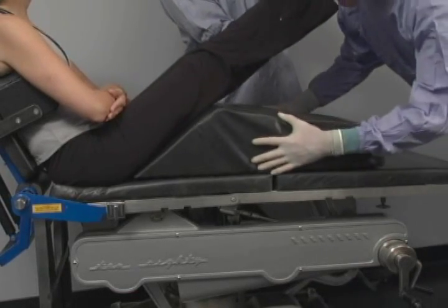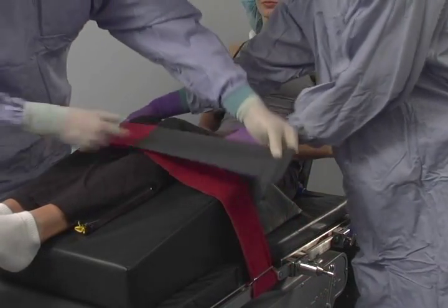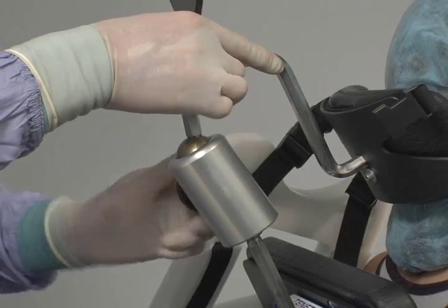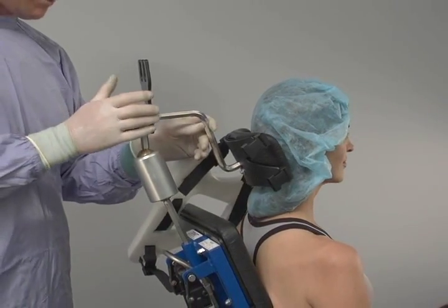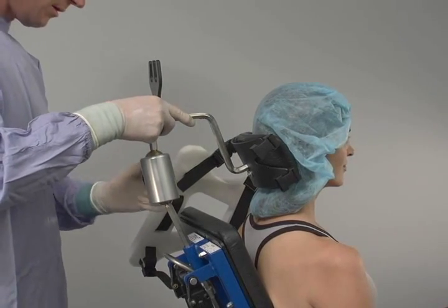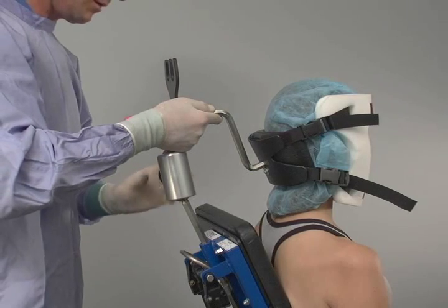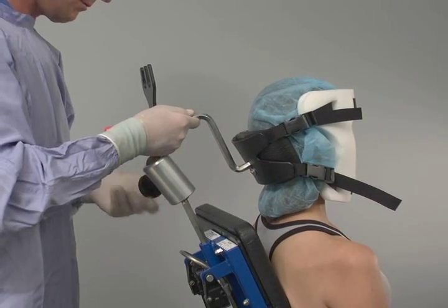The knee bolster prevents the body from slipping down the OR table. A table strap is provided to secure the patient's legs and prevent translation down the table when reclined. The headset has great adjustability, allowing a full range of positions and ensuring a neutral head position. It can be adjusted up and down and has a double ball and socket joint to allow tilting and rotation. It also has an extra adjustment to accommodate older patients who have severe kyphosis in the neck and back. The stability of the patient and maintaining a clear airway are primary concerns of the anaesthetist with beach chair procedures, so the TMAX was designed so that the body remains in one position throughout the case. The disposable face mask is designed to keep the patient's airway in a neutral position, ensure the head remains still, and help control the head for slight rotation or tilting when attempting to gain better access to the shoulder during surgery.